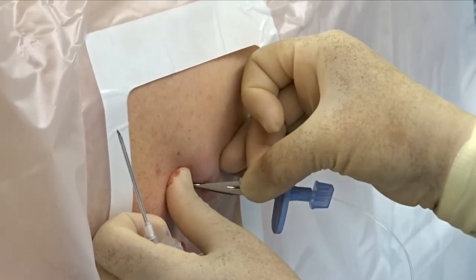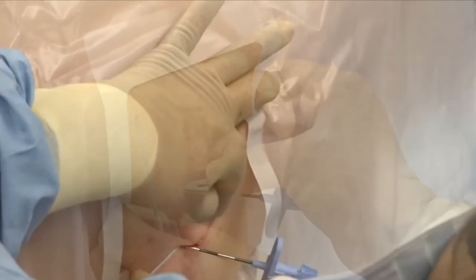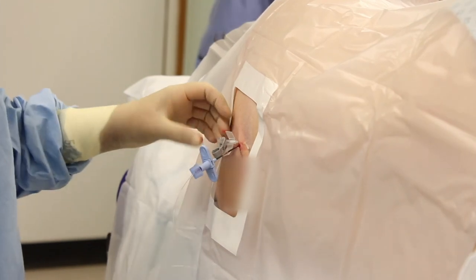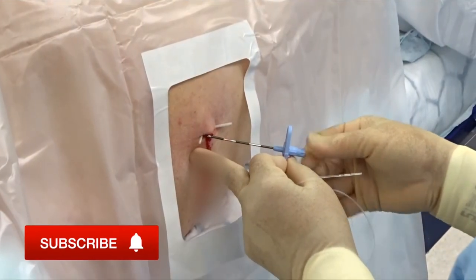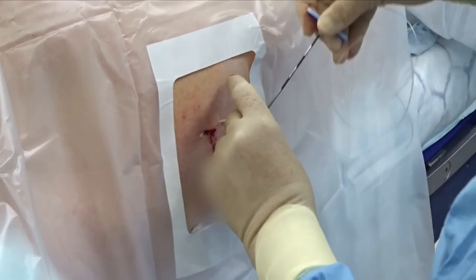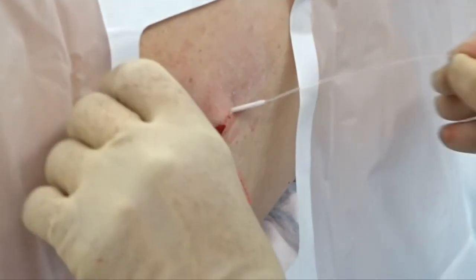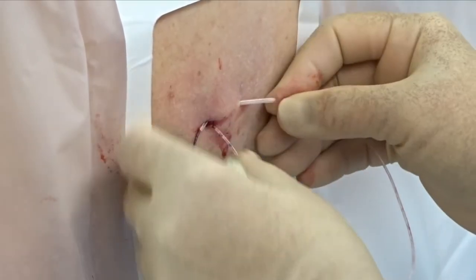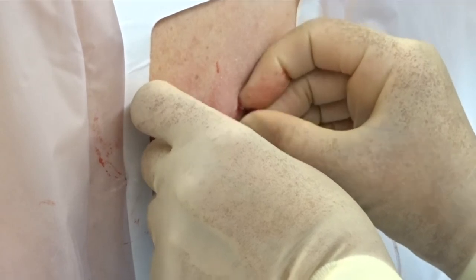A useful technique for securing the catheter and preventing its accidental dislodgement is to pass a large bore venous cannula through the skin, then using a scalpel blade, detach the cannula hub, leaving the catheter component of the venous cannula as a tunnel within the skin. While securely maintaining the position of the epidural catheter, we carefully remove the introducer needle before feeding the epidural catheter through the tunnel in the skin formed by the venous cannula catheter. Having pulled the majority of the epidural catheter through this tunnel, we remove the venous cannula catheter and securely snug down the epidural catheter.